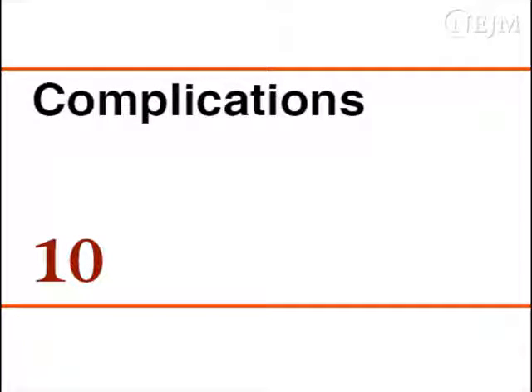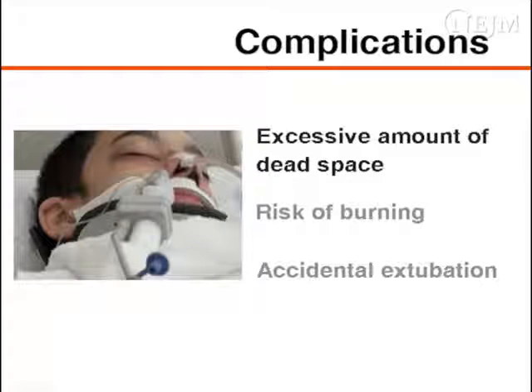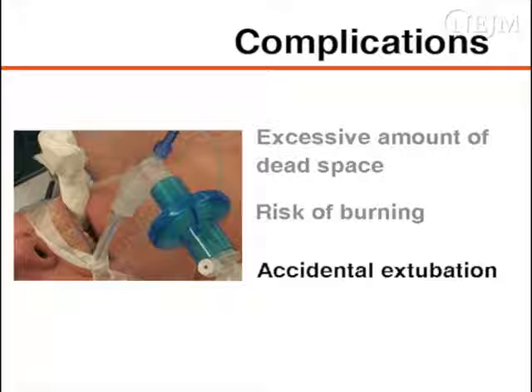Complications. Although capnography is generally safe, its use still carries a small risk of adverse events. Mainstream analyzers may introduce an excessive amount of dead space into the ventilator circuit. Older generation mainstream sensors use heat to inhibit the condensation of water vapor and prevent falsely high carbon dioxide readings. But this increases the risk of burning the patient's skin. Also, to reduce the risk of accidental extubation, caution must be taken to minimize the amount of additional weight placed on the airway.